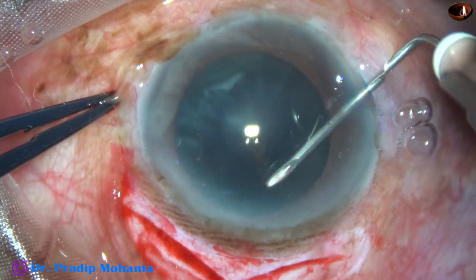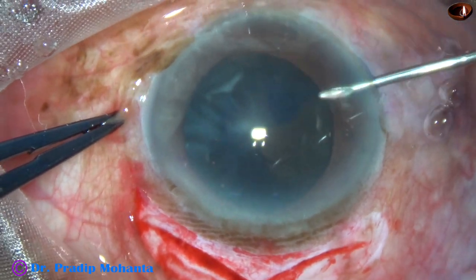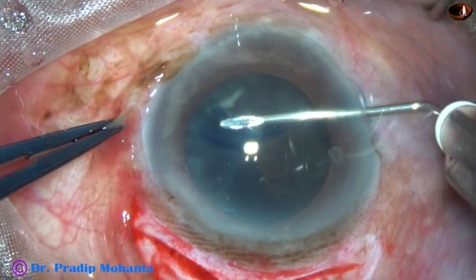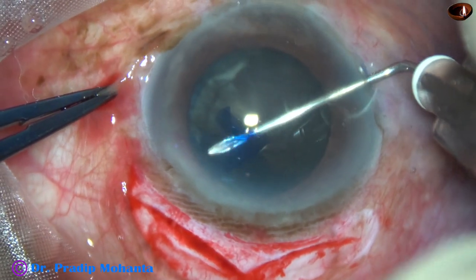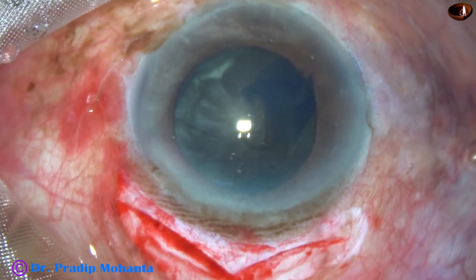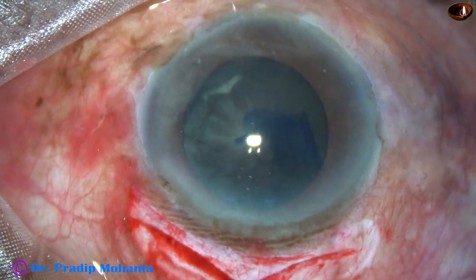So I am planning a large rhexis. Here at 9 o'clock I go beyond the margin of the pupil, then come back, and now the rhexis is visible. Again at 3 o'clock I go beyond the margin of the pupil and bring it back. Thus I have got a large rhexis, which will help in prolapse of the nucleus into the anterior chamber.